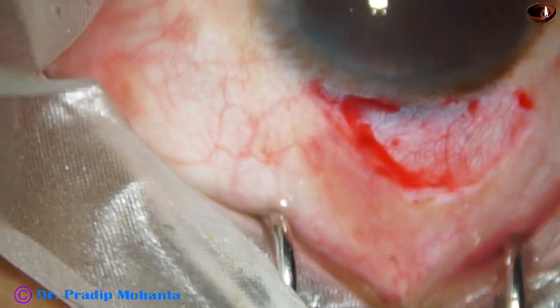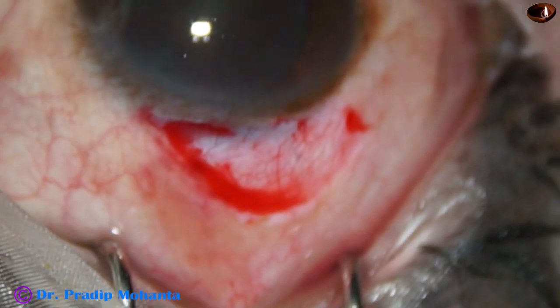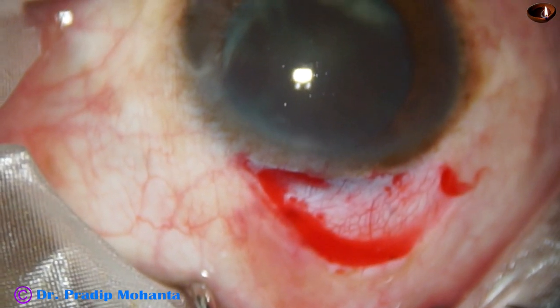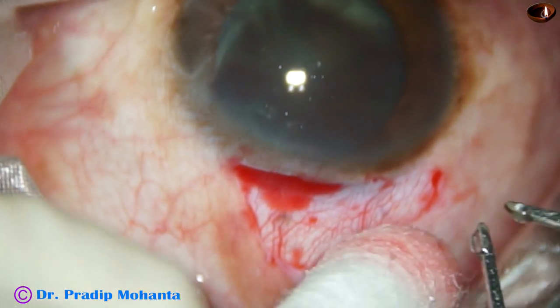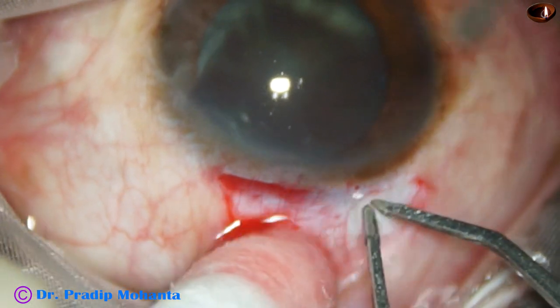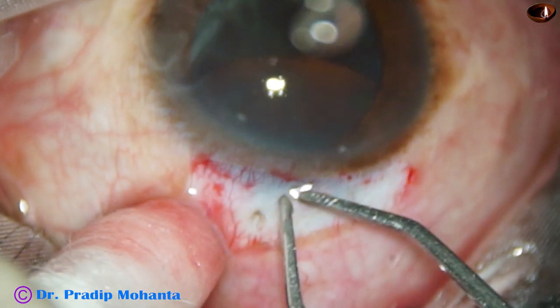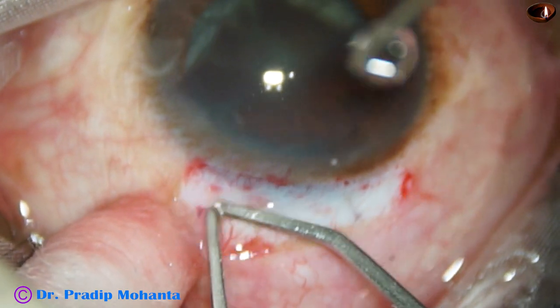We can now do bipolar wet field cautery, but the cautery should be very mild. We should not cause any contraction and charring of the scleral surface. The assistant should put BSS drop by drop, and very mild wet field cautery is done.